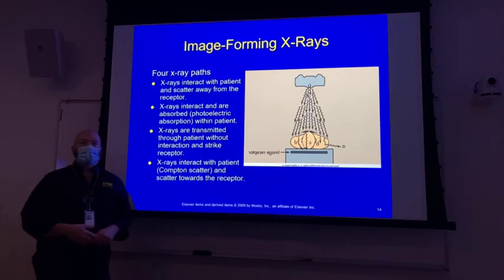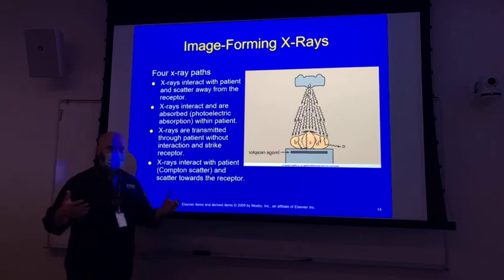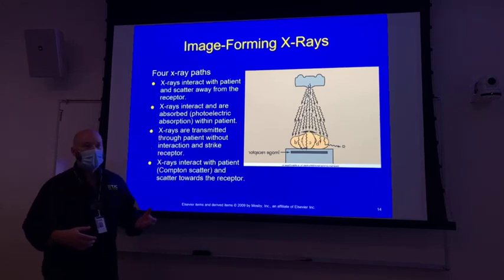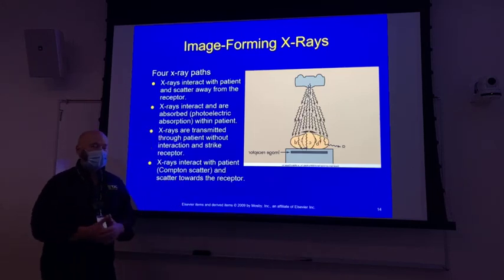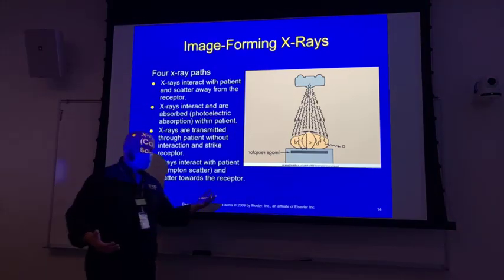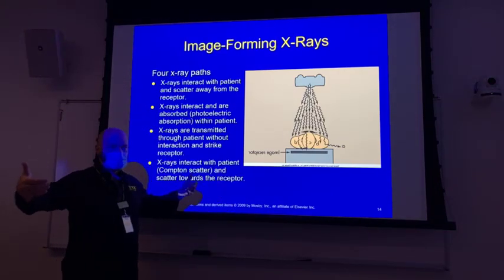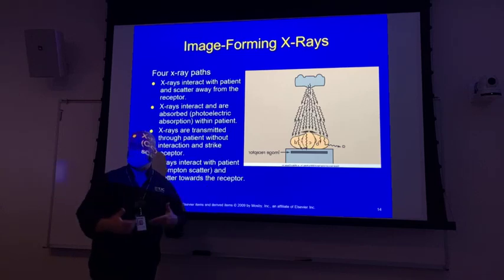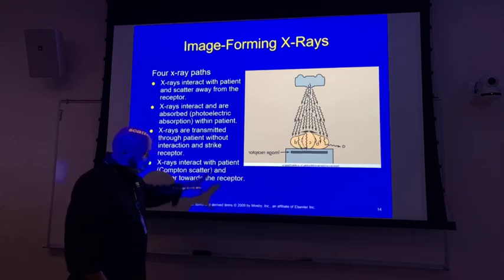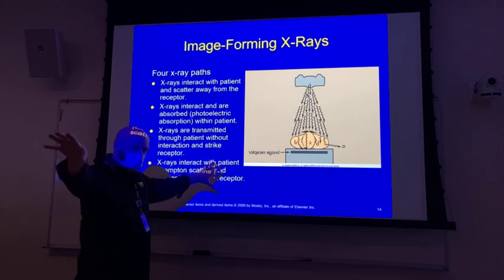If the patient was a trauma patient, obviously we were doing it in a trauma room, but if the patient could come to the department, even if they were on the backboard, we'd wheel them down to the department and get better images. So the setup of the room was such that we had to shoot. The dark room was well shielded, so it didn't get a whole lot of scatter radiation inside of it, but we had to shoot directly towards the dark room. All right, so this represents the wall. I got a table here and I got a table over there. Okay, so dark room is here, table over here, table over there.